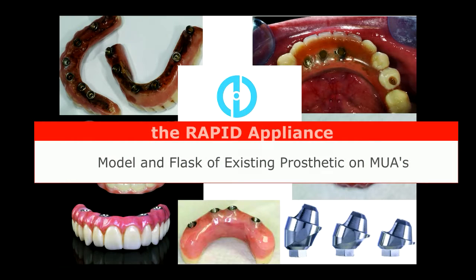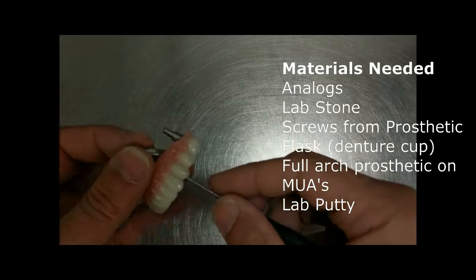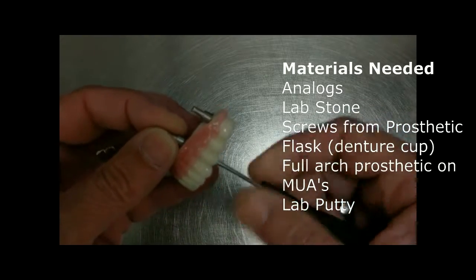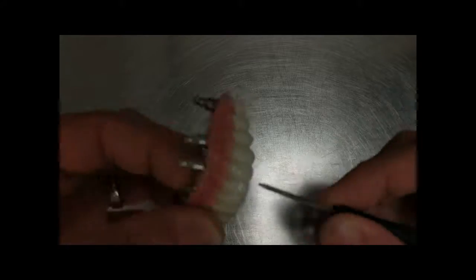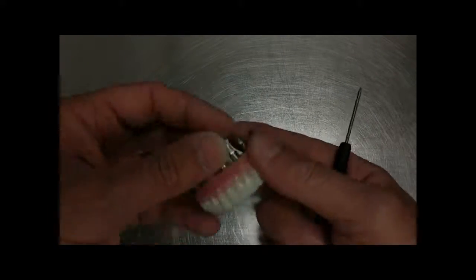The materials needed are a full arch prosthetic that is designed on multi-unit abutments and multi-unit abutment analogs that are compatible with the implant system. The first step is to remove the prosthetic from the patient. Then, carefully clean with a toothbrush or an ultrasonic around each implant site. They must be completely free of any debris in order to ensure that the analogs fit perfectly into each site.